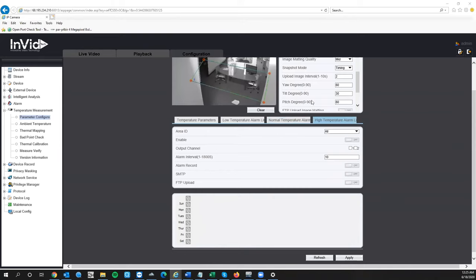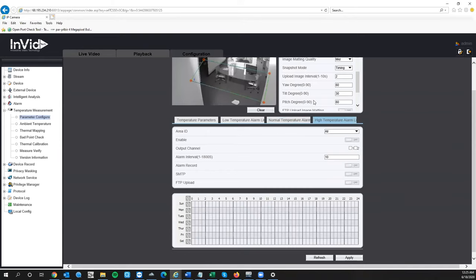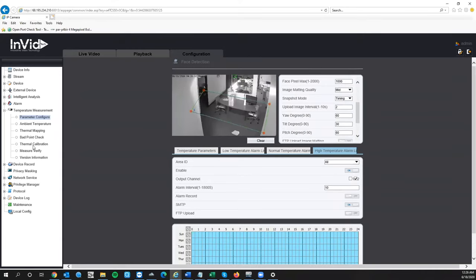For the high temperature alarm, hook up a red light to alarm output two, check the box, enable it, and set a schedule similarly. You might also want to set up an email alert — every time a high temperature comes in, you'll get an email with a screenshot of that person's temperature reading. That's how you set up the alarm outputs. If you're not using alarm outputs, you can skip this part.